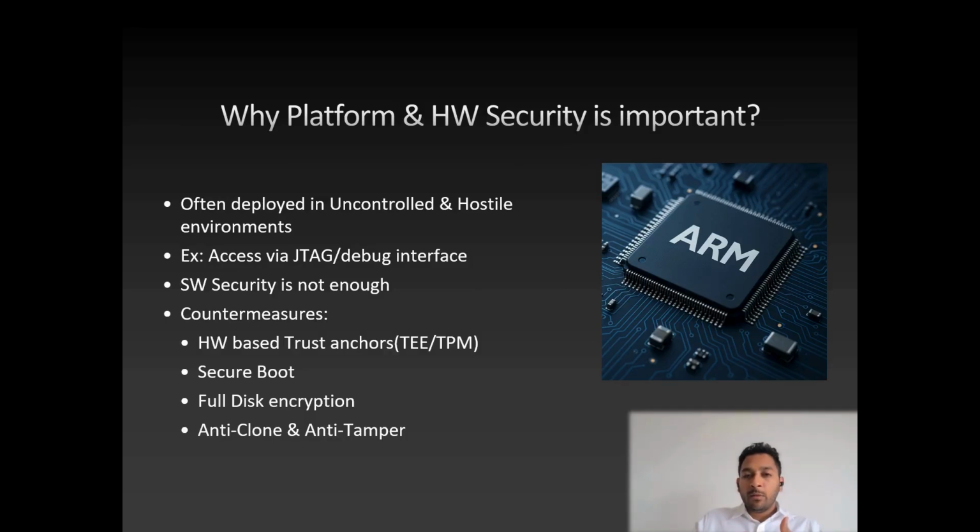Let's talk about something most people overlook, platform and hardware security. These devices are going to be deployed in what we call an uncontrolled or hostile environment. It means anybody could walk up to your device, try to tamper with it, try to clone the software. For example, if the hardware external interfaces are exposed or don't have proper protections, an attacker could try to access them and modify the boot parameters to boot into Linux with root privileges.